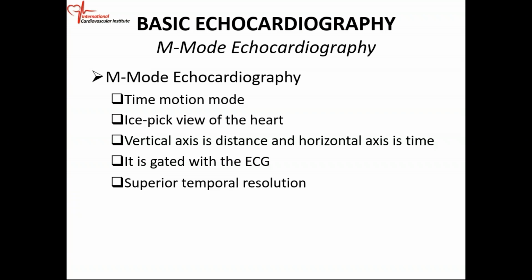And then the duration of diastole on your ECG is from the end of the T wave to the QRS. And when we say systolic, the mark is usually on the peak of the T wave, but we know the duration of systole is from the QRS to the end of the T wave.